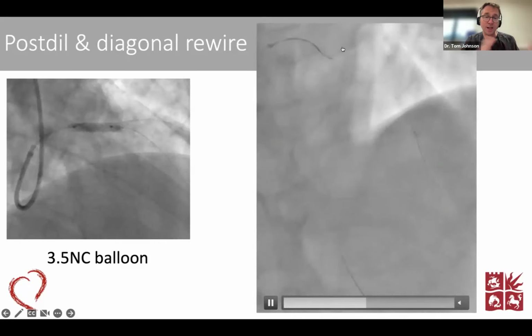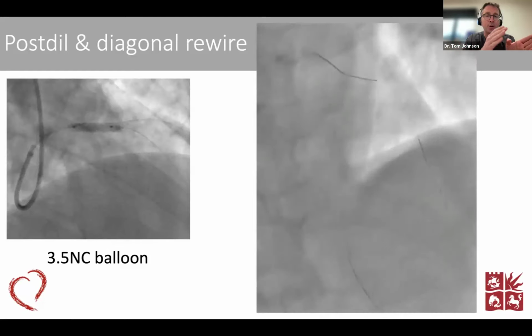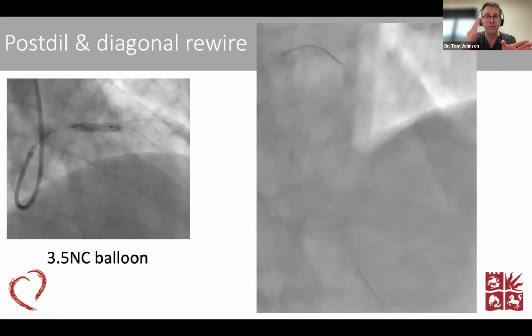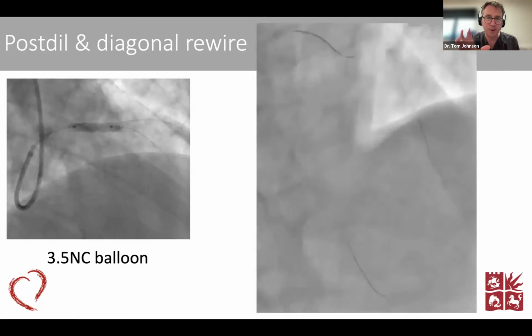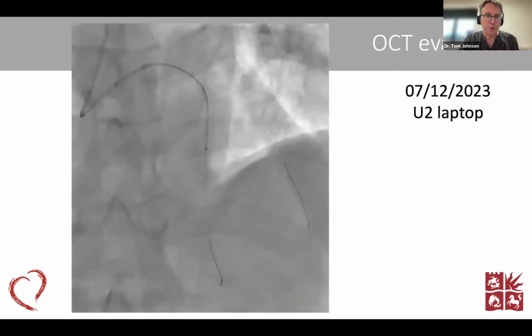But had I just taken the imaging because I was focused on the distal stent edge, I'd have lost then. I'd have then definitely had to go back and do further imaging to optimize and make further decisions. So it's just about rationalizing the timing at which you do things. So this is the point at which we take the OCT.